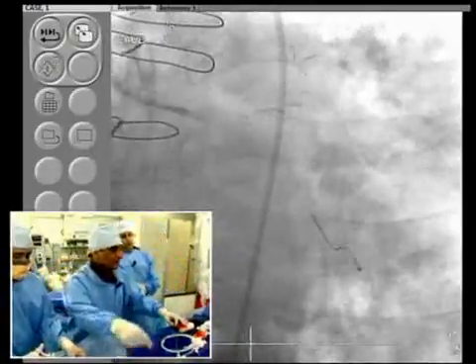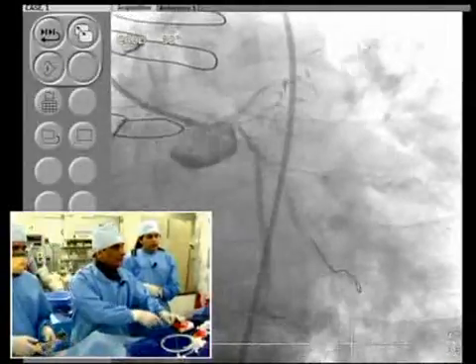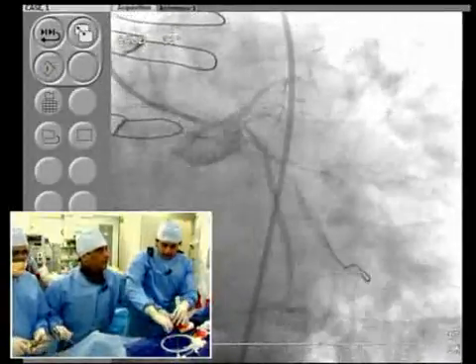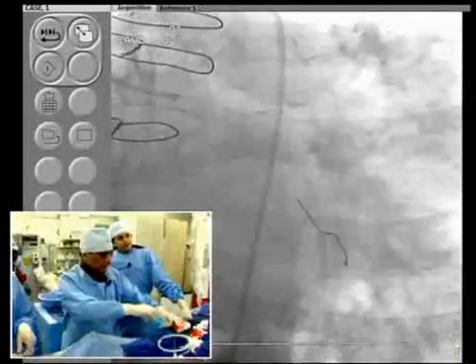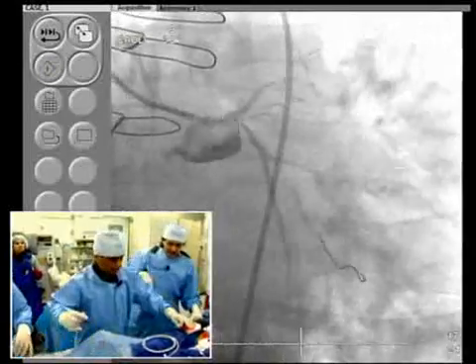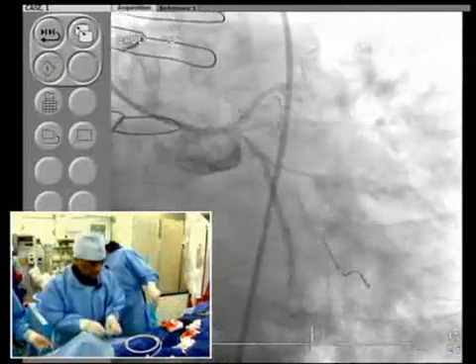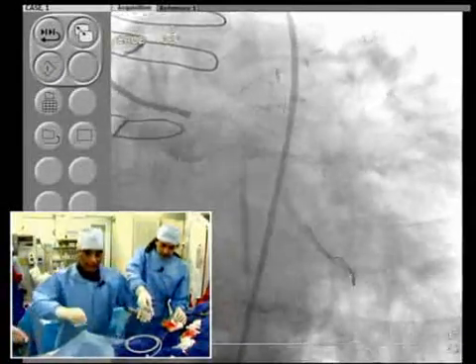We had to go to the main vessel, the wire. Why? Yes, because now the question is, you can place it right there. The stent, or no? No, take it out. Don't break it. You don't want the wire in the main. That's what we are debating. I'm telling him it's okay, leave it there, just place the stent before the bifurcation and come out. Right. That's actually very good also, because that will keep the lumen, because we need the circ lumen.